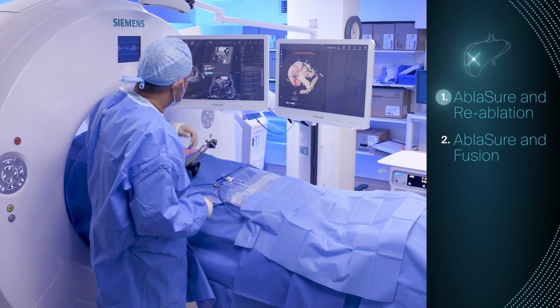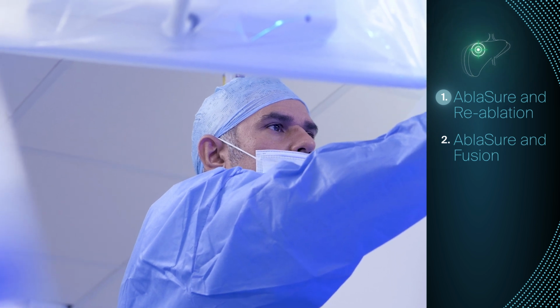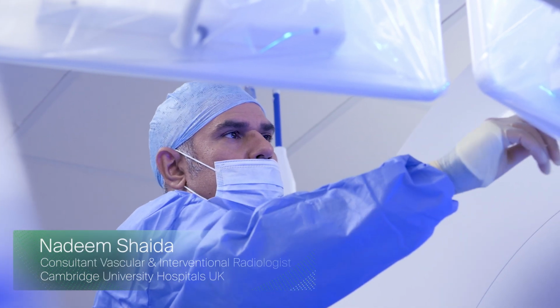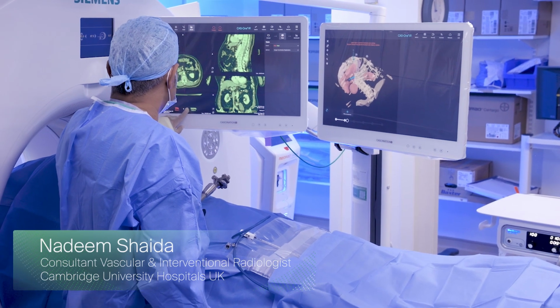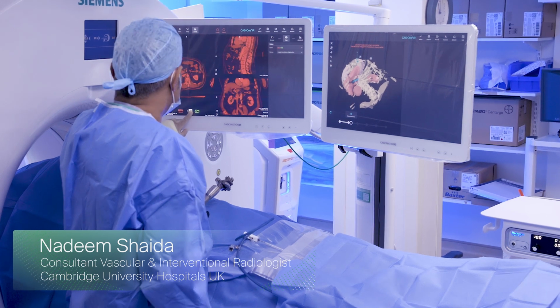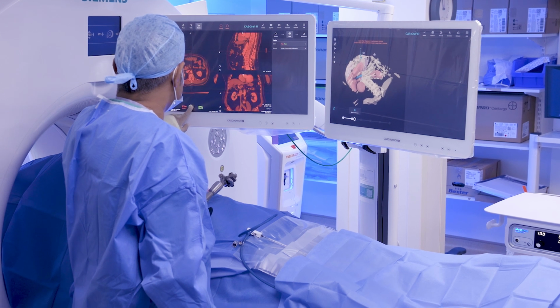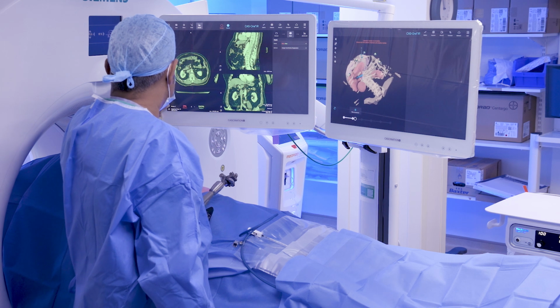Okay, so now we are back after ablating the second smaller lesion, and once again we have a quick scan to check through both sides. There is a little bit of sagittal movement on the coronal plane, but not a lot, and probably the fact that we've already done an ablation in that area is having an impact as well, but I think acceptable.